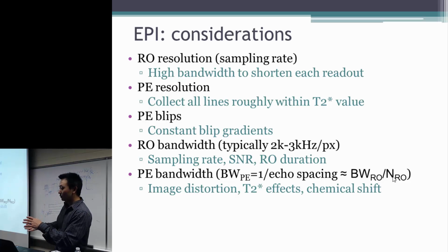How do we say? If we just change the field of view by rotating it so that the new readout is along the original phase encoding, then the original readout is now the phase encoding. So there is still the same distortion, the same chemical shift along that direction. Not in the previous direction, right? Mm-hmm. Not in the first direction. Yeah, not in the first direction.